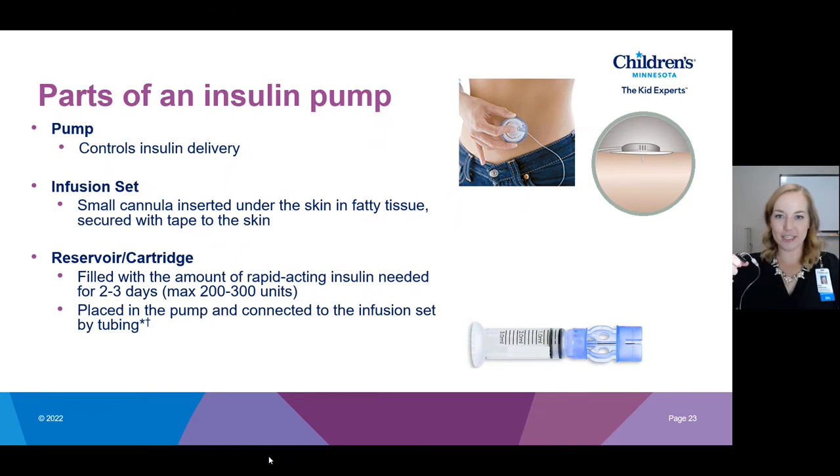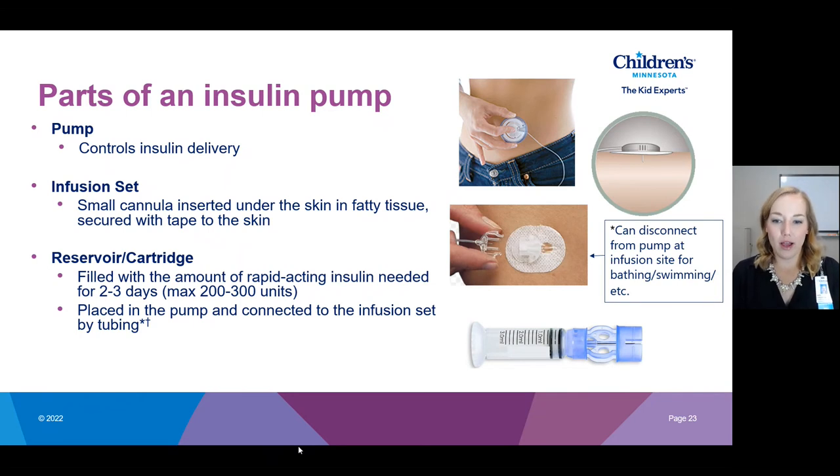So those are the basics of how that all goes together. The big takeaway is that the three main parts of a pump are: the pump, the infusion set, and the reservoir. A reminder that you can disconnect from the site without having to pull that infusion set completely off.